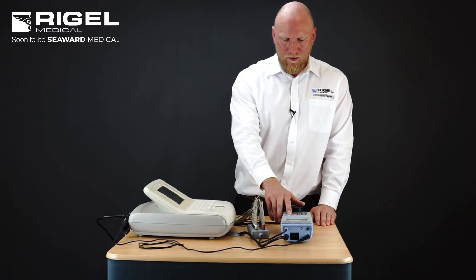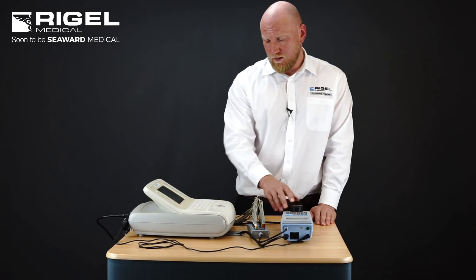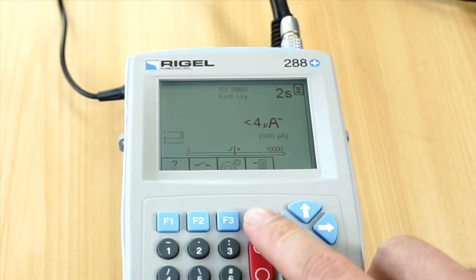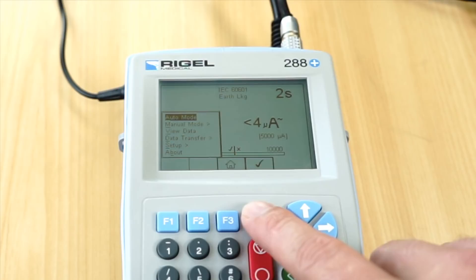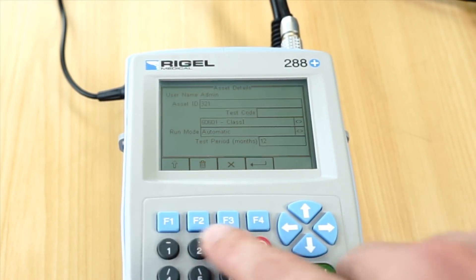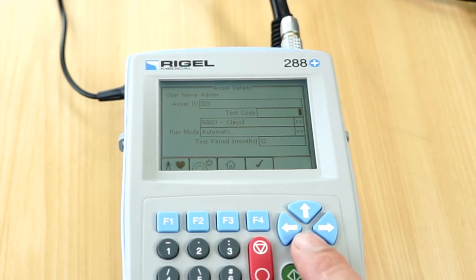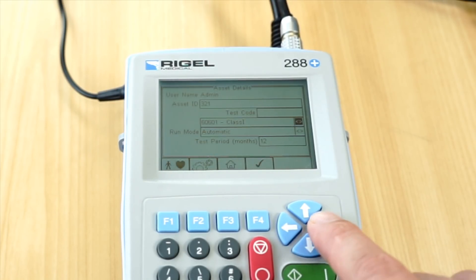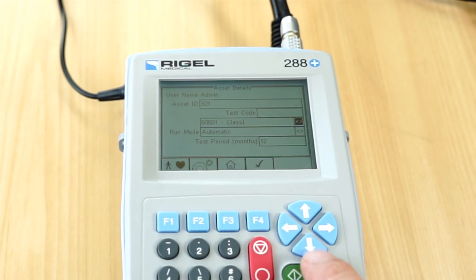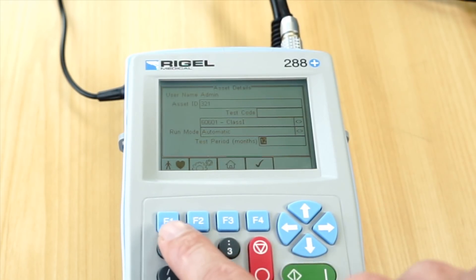We are going to power the 288 device on once we are satisfied with all of the connections. We are going to press F4 to highlight auto mode, then enter the asset ID that is on the medical device. We are going to select the classification of the medical device — in this case it is a class 1 device and we are going to test under IEC 60601. The test period will be 12 months.